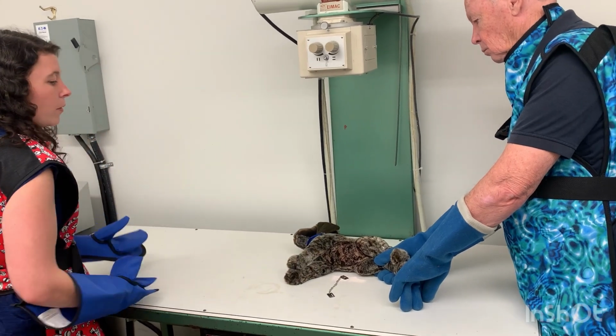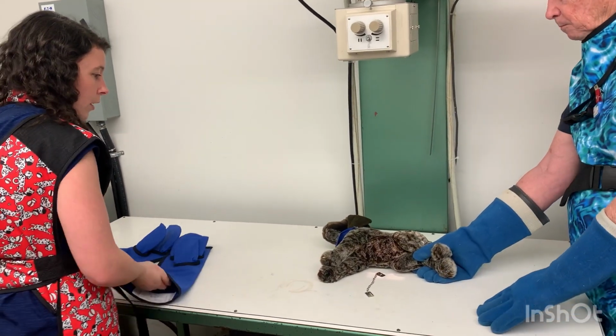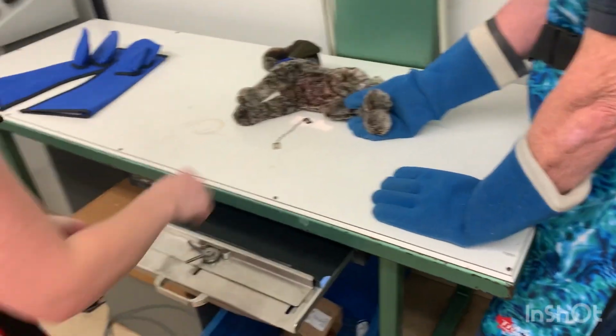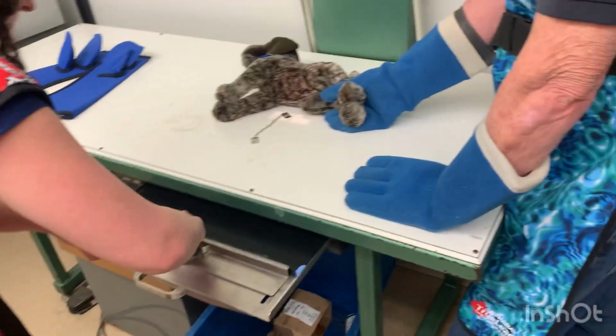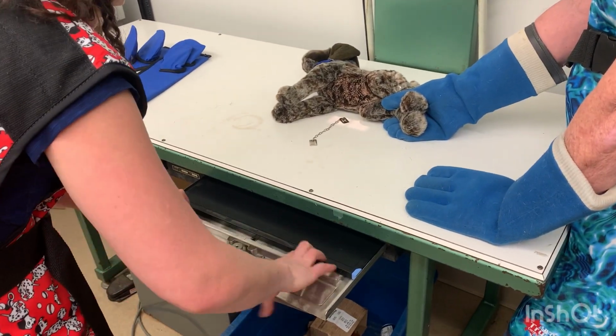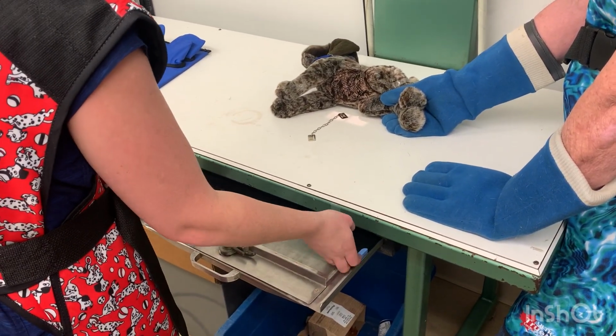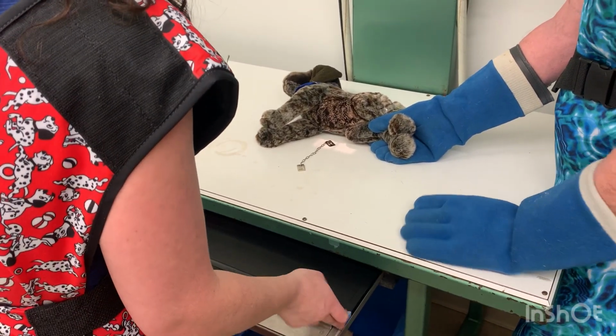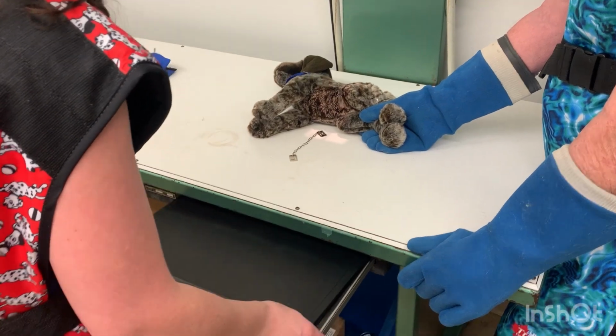Okay, now what we would need to do for this is we would take out, so if you can just stay with our patient so it doesn't leave the table. We take out our PSP plate. The latent image is now stored in here. I'm going to come out a little bit this way.